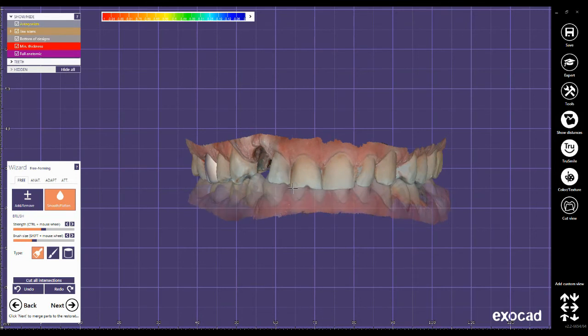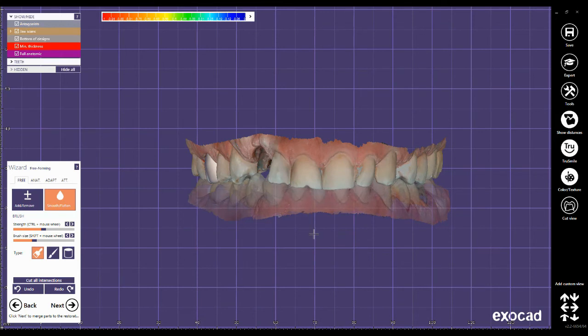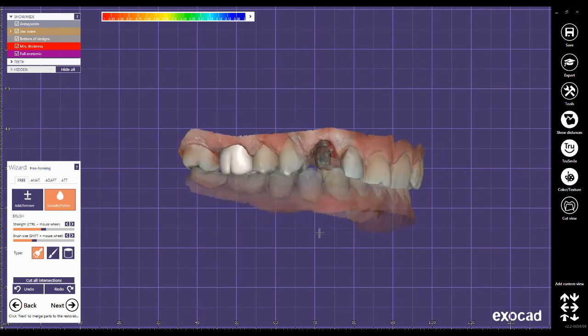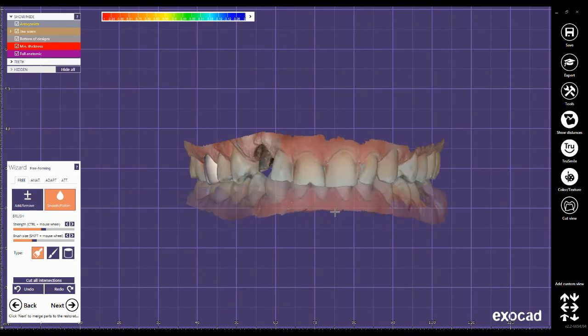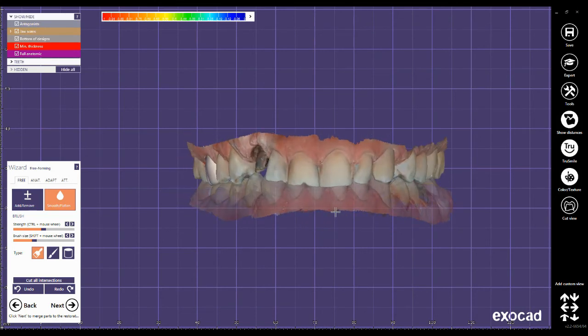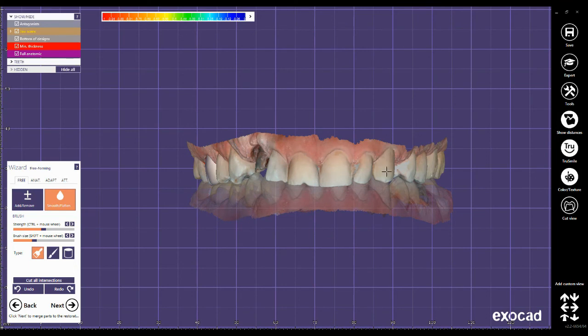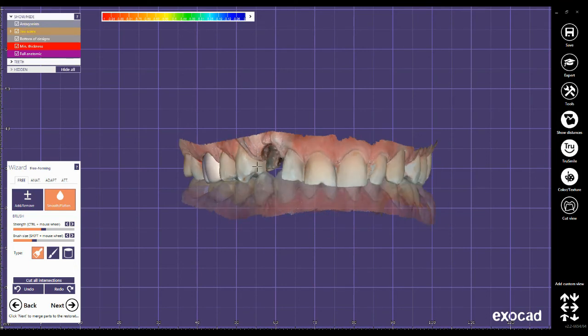This file is sent via CareStream intraoral scanner 3600. The only problem here is that I don't have the color detection, so the color that you see here is not the main color of the patient's tooth. So I need to ask this color from the dentist.